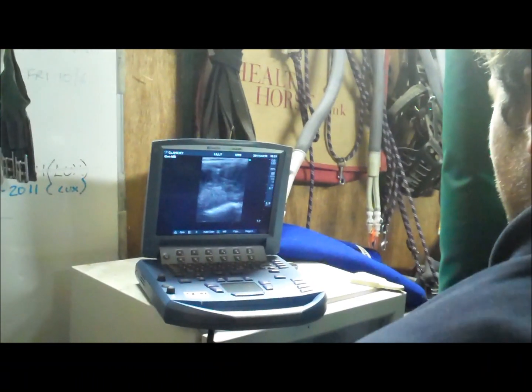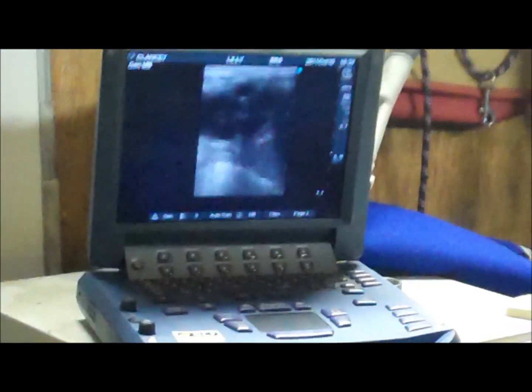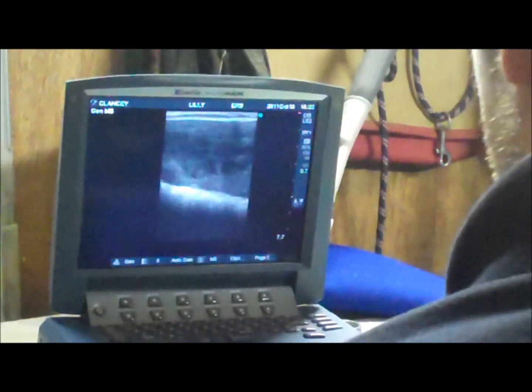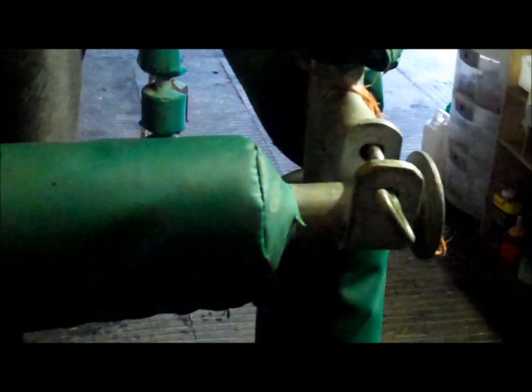Nice uterine pattern. In the uterus. Another ovary — mixed activity. No fluid. All looks clean. So that looks optimistic for next spring. Alright, have you got any semen? Let's inseminate her.